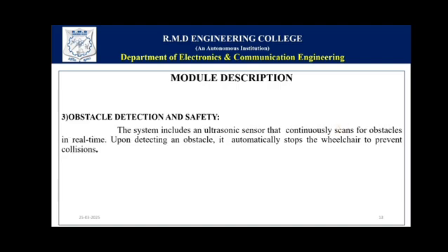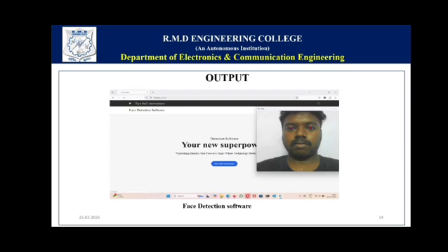The last one is obstacle detection and safety. The system includes an ultrasonic sensor that continuously scans for obstacles in real time. Upon detecting an obstacle, it automatically stops the wheelchair to prevent collision.